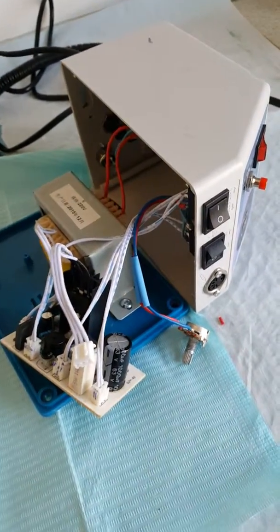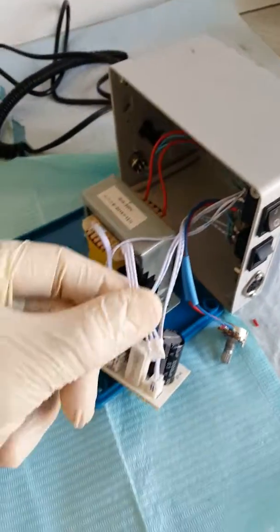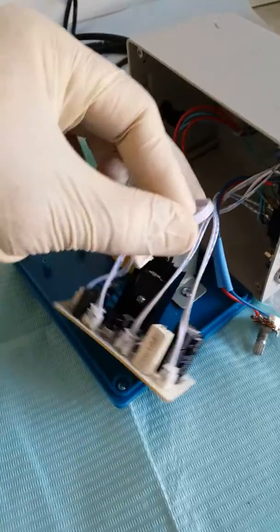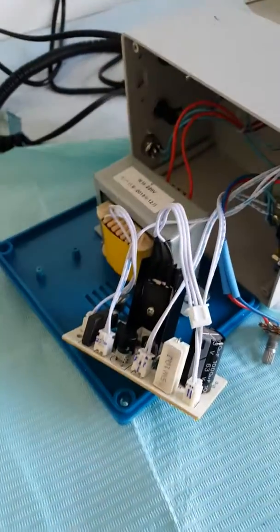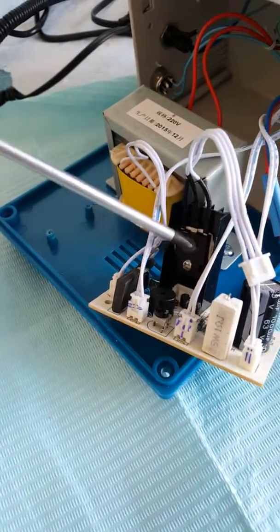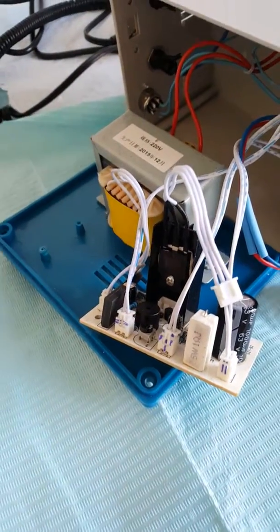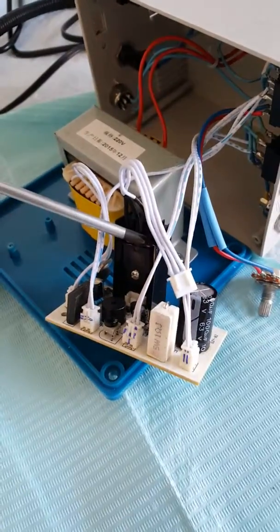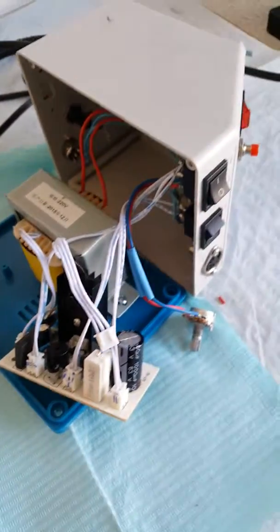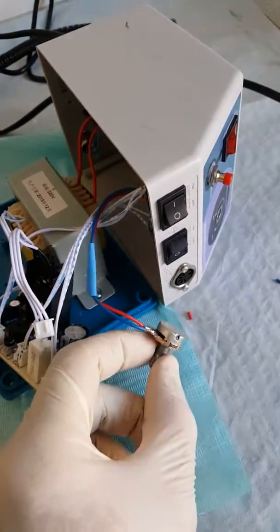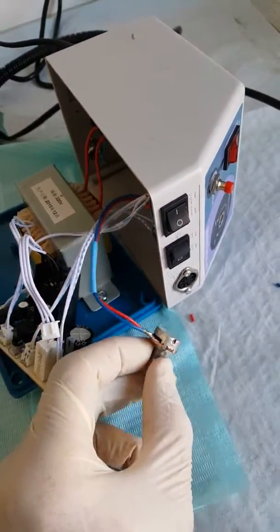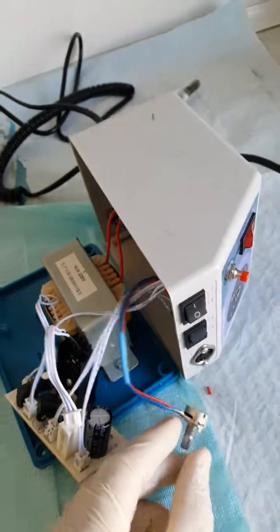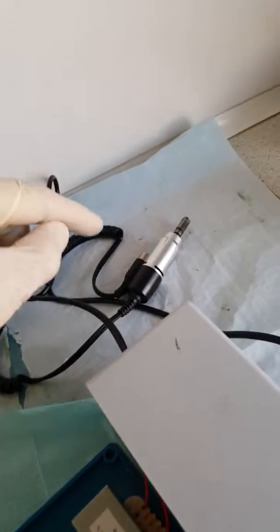opened it up and connected this little thing here from the other Marathon to this Marathon. And again I could adjust the speed and the potentiometer would put it to minimum and maximum speed of the handpiece.